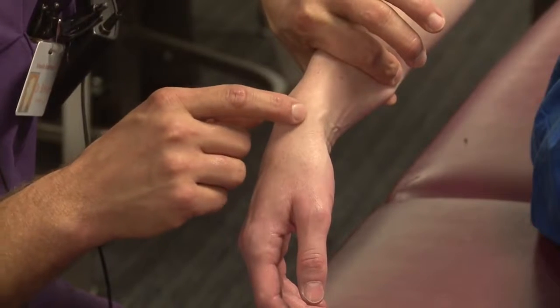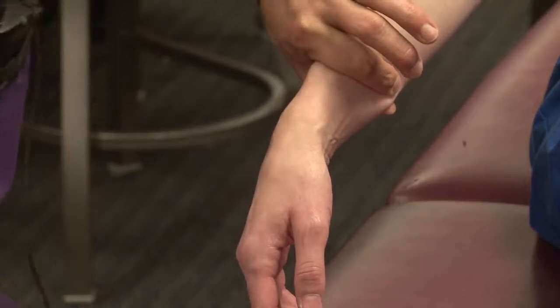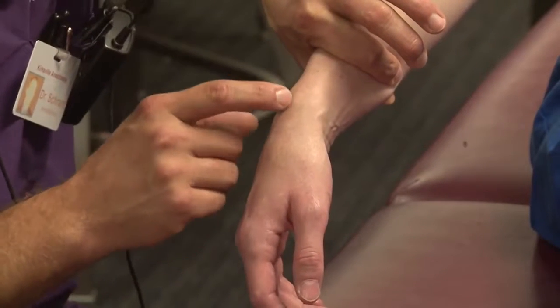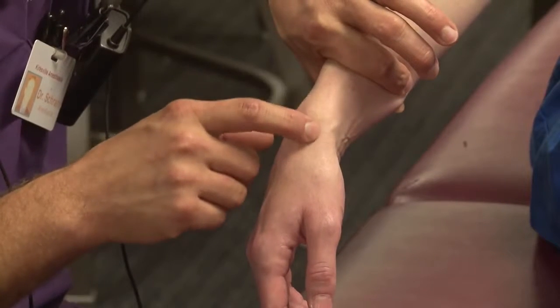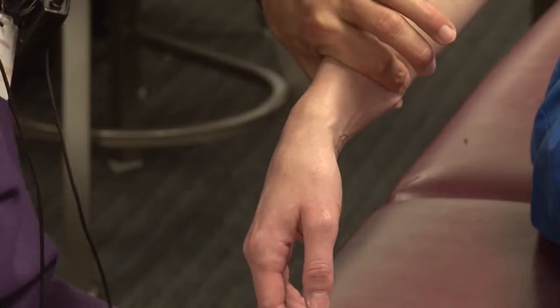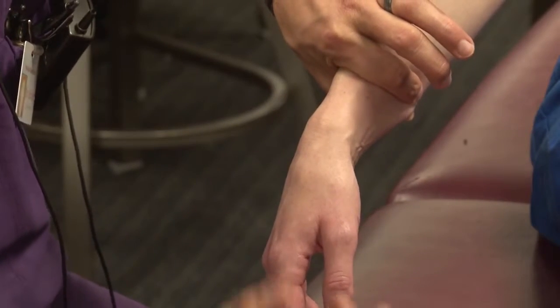It doesn't show up visually very often, but it's the cephalic vein? Yeah. It's a really nice one here. For some reason, at least around here, nursing tends not to use it, and that means it's left for me.